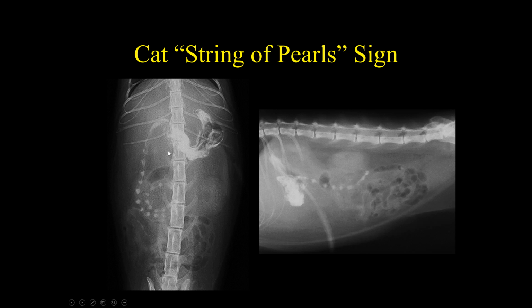This is a cat thing where the way I used to remember it is cats are different, right? This part of the duodenum right in here has probably never in its life, quote, seen barium before. And it looks at this stuff coming through it and goes, holy shit, what is this stuff? And it contracts down in a panic moment. Then it forms these little pockets of barium. And then it finally figures out that, oh, this stuff isn't so bad. And then it relaxes, okay?